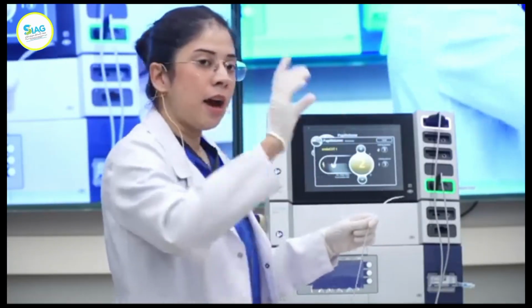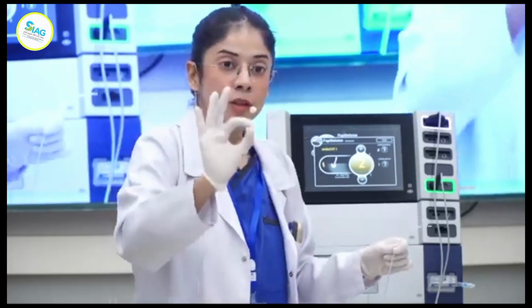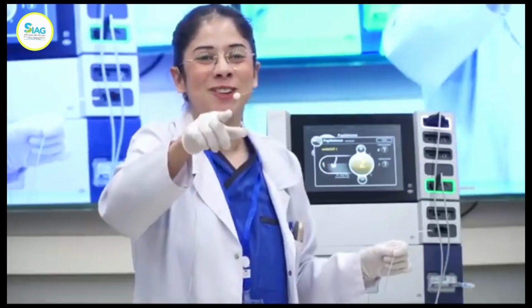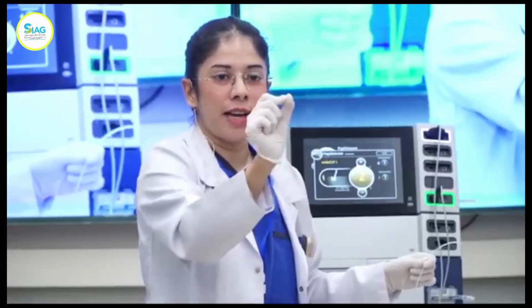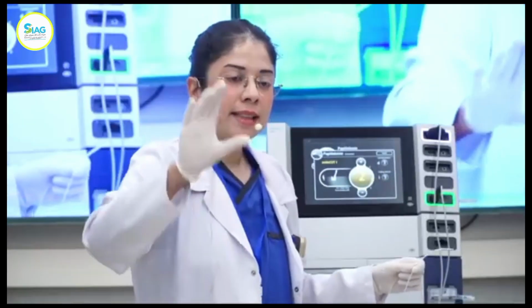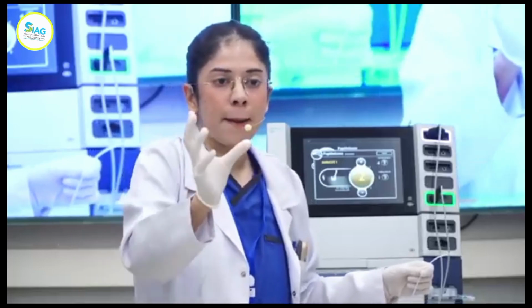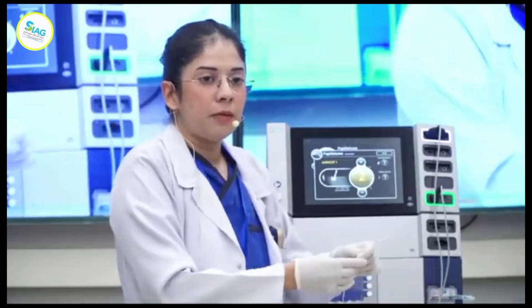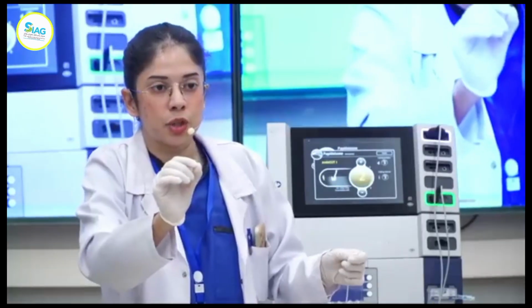So you're cutting at 100 degrees, for example. And that music you hear, where the da-da, da-da, you have to listen to it. I know that always makes Dr. Asim laugh. That interval is basically the change of modes. So you have cutting, pause, and that's the waveform pattern you get, an interruption. That interruption is the cooling of the tissue that'll let the surrounding tissue heal, the capillaries to kind of heal. So what's the benefit? If I'm a new trainee and I'm doing ERCPs, I would prefer endocut. Why? Because my sphincterotome will automatically pause a little bit and it'll burn the capillaries of the surrounding tissue.